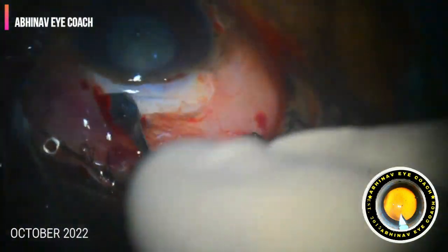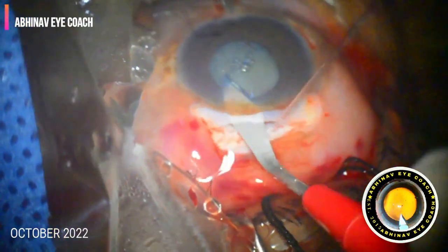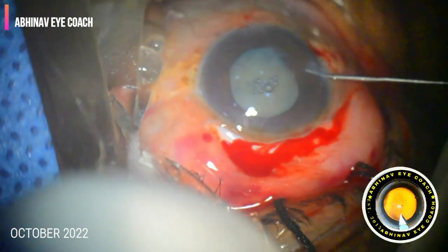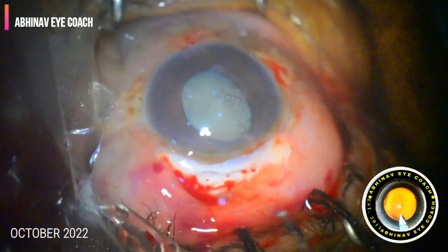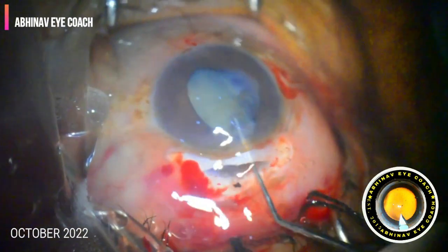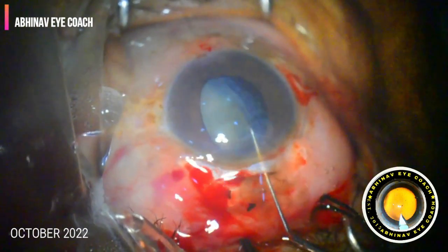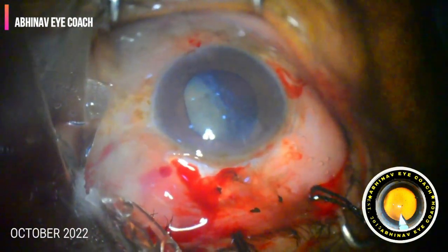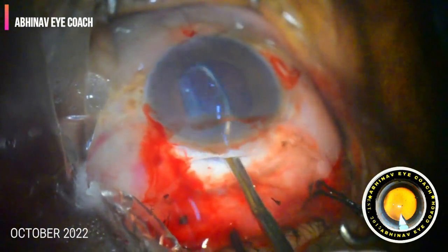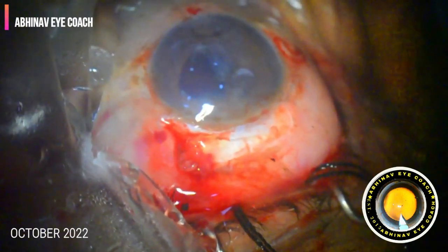We proceeded with the routine scleral tunnel and entered the anterior chamber. I first tried to elevate the nucleus with hydro, and with the Sinskey hook I tried to bring the nucleus up into the anterior chamber. I could see a large transparent bright reflex, showing there was no posterior capsular support behind the nucleus. Very carefully, with wire vectis, I delivered the nucleus directly out of the anterior chamber.